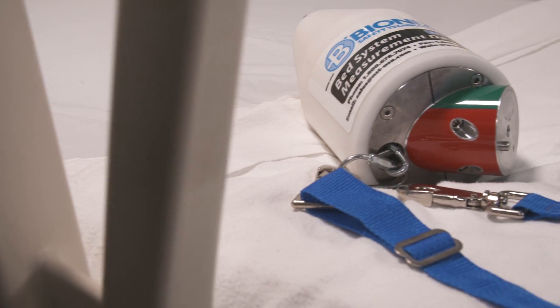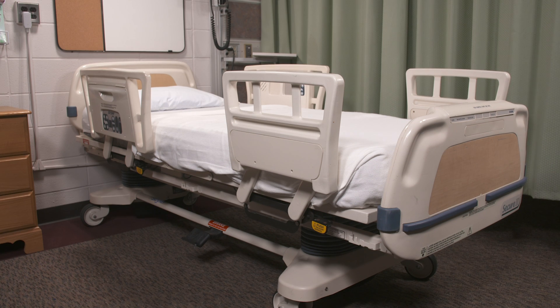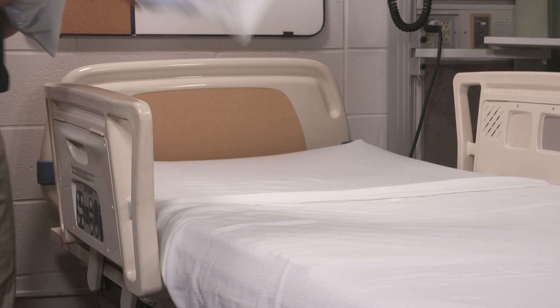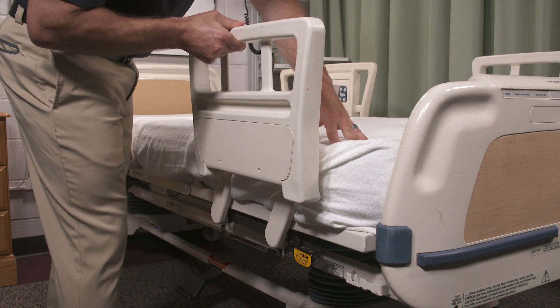To test Zone 2, you will need the cone and scale of the bed system measurement device and an unoccupied hospital bed in a flat horizontal position. Lock the wheels, remove all pillows, and raise the bed to a comfortable working height, keeping the sheets in place. Remember to fully raise all bed rails.